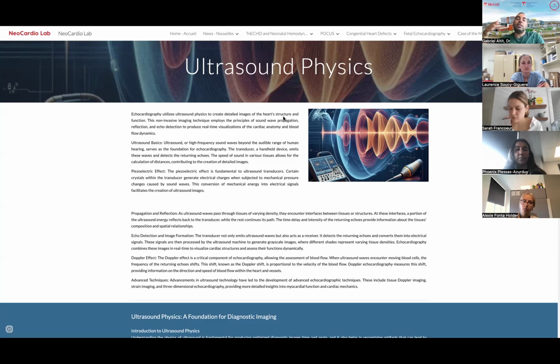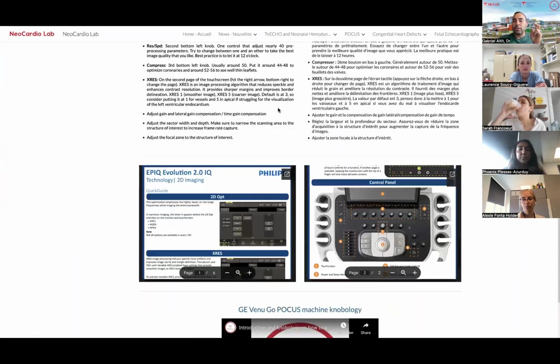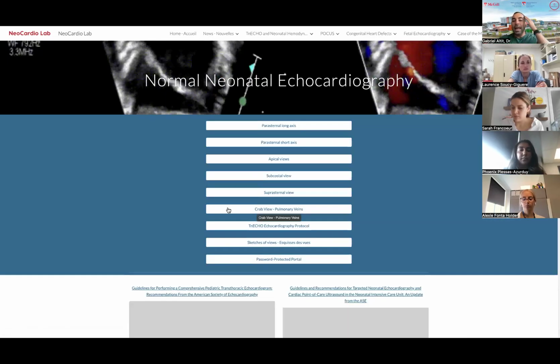So you could actually translate that into a noise, which is what we often do in Doppler, or you can retranslate that into an image, based on color or 2D or whatever you want to reconstruct. But obviously that means the ultrasound machine had to liberate some kind of force or energy. So machines and probes have certain safety standards to make sure that the amount of energy transmitted is not toxic and is not going to cause potential tissue damage.